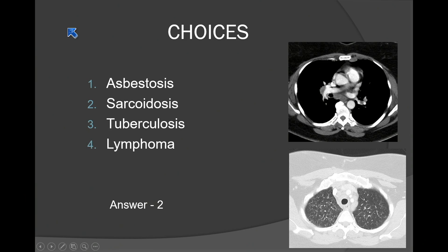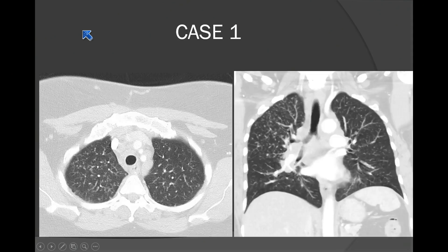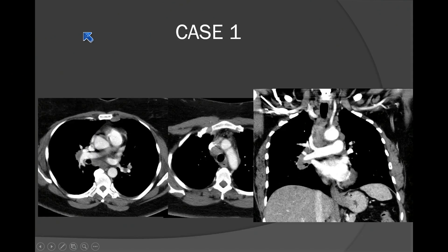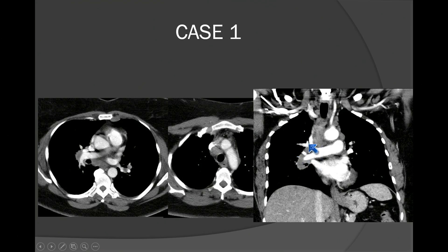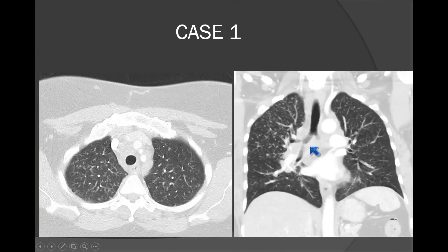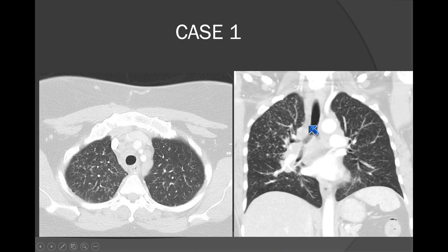Asbestosis is really the one that is not in the differential. The thing that might help you is there's a lot of symmetry here — that favors sarcoidosis. You can have what's called miliary sarcoidosis, which is often peribronchovascular.